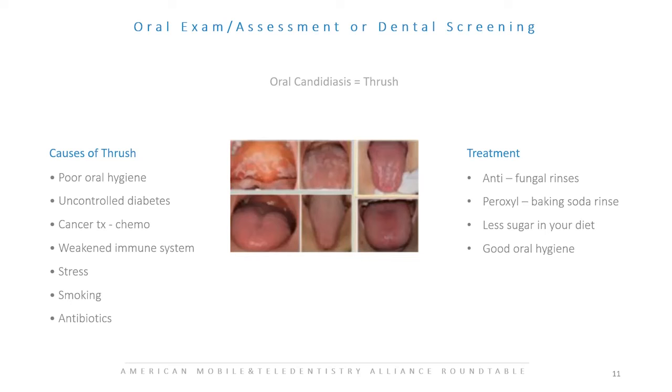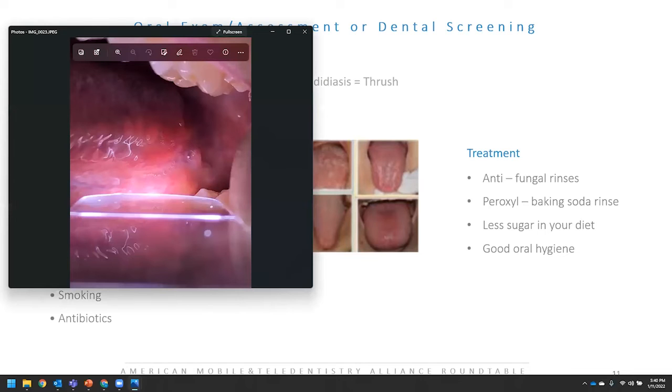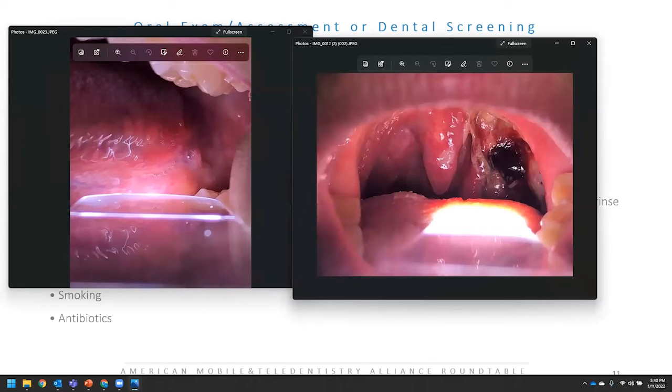Awesome. And then real quick, I did want to share some TelScope images that have been taken, especially for oral cancer, and this looks like tonsillar cancer as well. As you can see, the high definition illumination really lets you get in there and see it with great clarity as well. Very detailed.